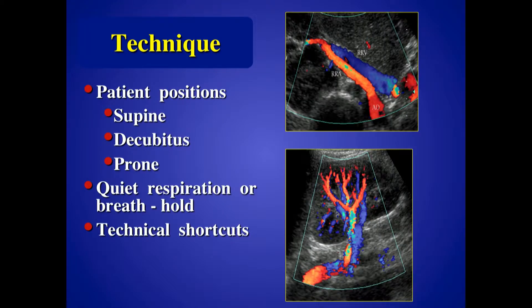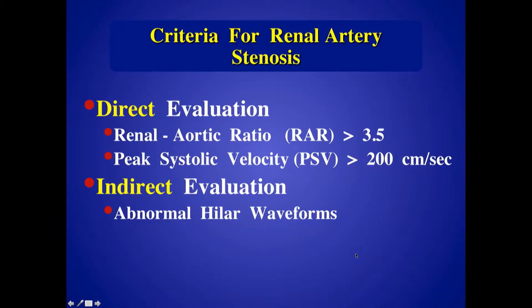Turning the patient allows you to get the views where you can see the artery and the vein. Here's the left renal artery scanning through the kidney — that's our window, we see it in its entirety. The criteria for the renal exam: peak systolic velocity greater than 200, coupled with an elevated ratio. The renal aortic ratio has been around a long time, pretty well established — greater than 3.5. And looking at the hilar waveforms.